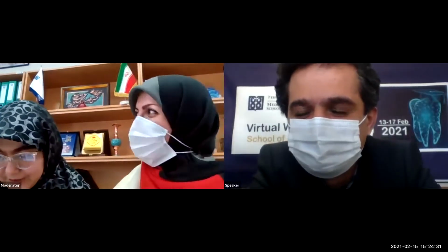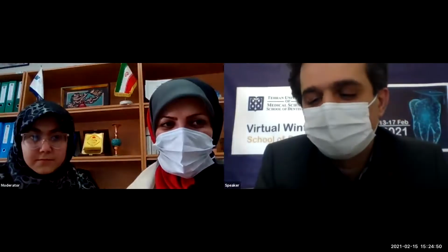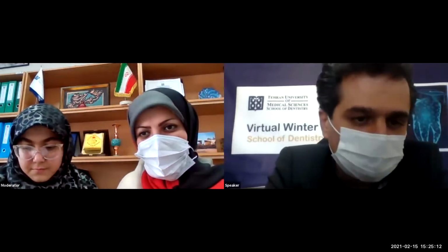By how many millimeters should a ceramic or zirconia or composite be over-contoured to allow for creation of these aesthetic features without compromising the original form and shape of the tooth being replaced? I think the best work is the minimal over contour, because, as I answered before, time is money, and it is best only during the finish phase and polishing phase. I am against the over contour, because I think it's better to make the anatomy the first time.